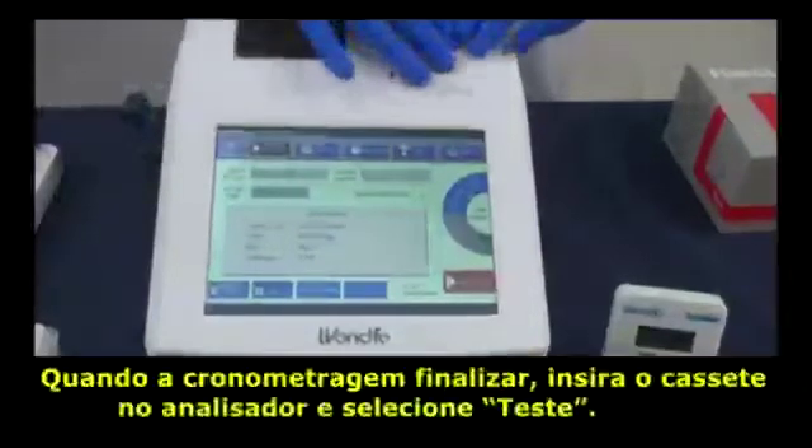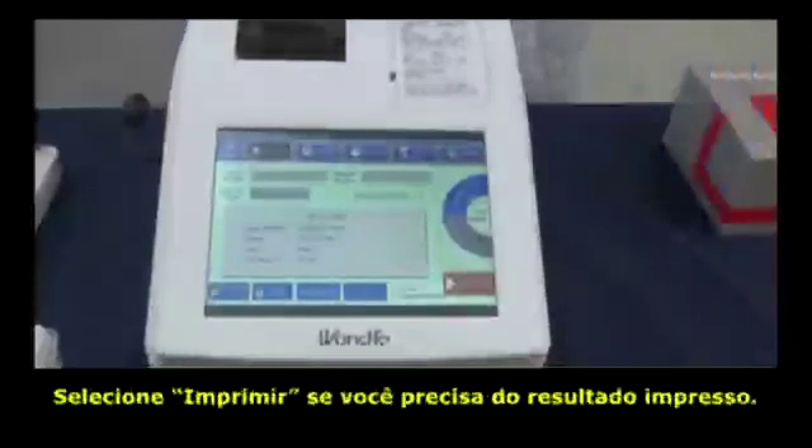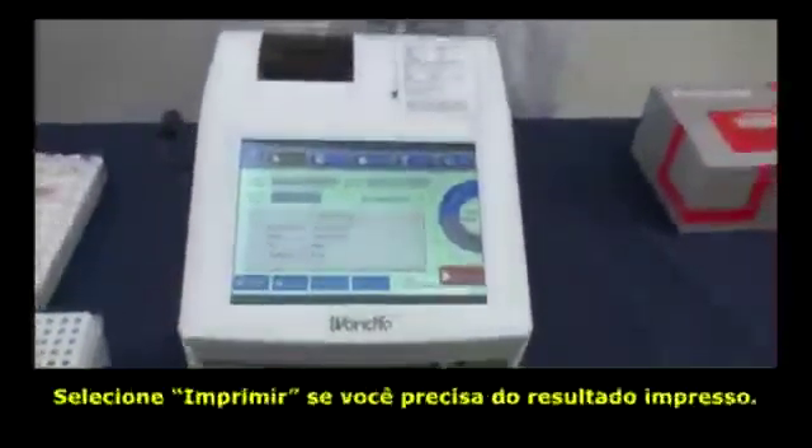When the countdown ends, insert the cartridge and click Test. Then click Print to print out the result.